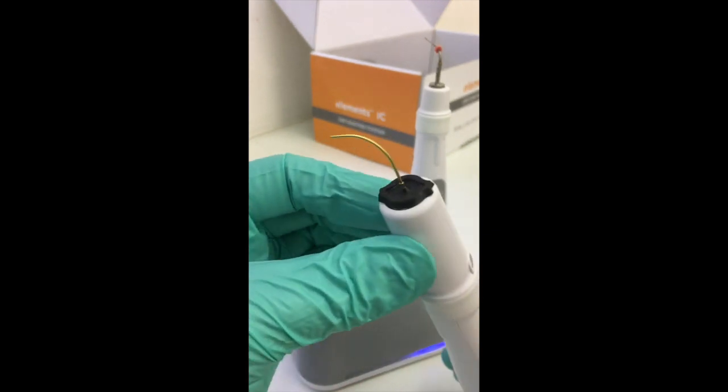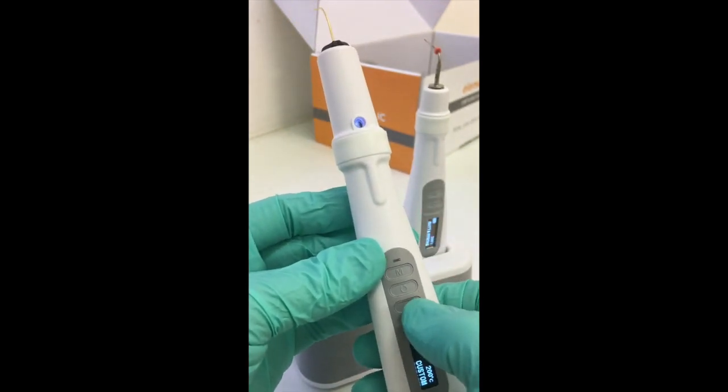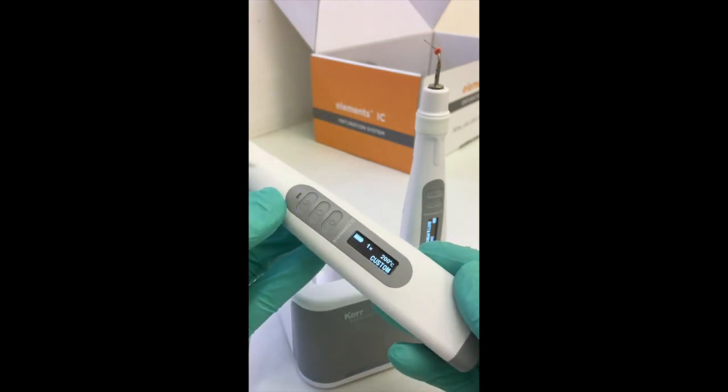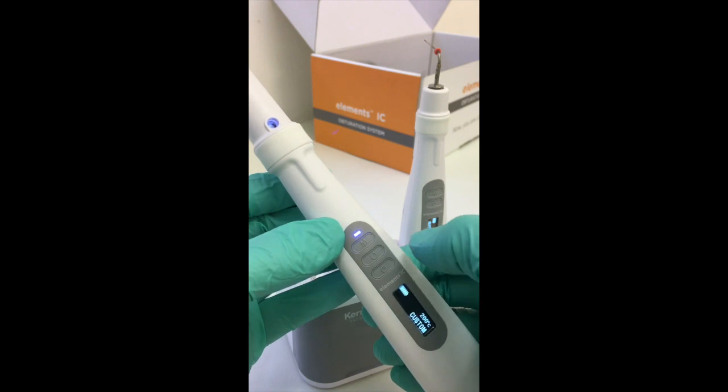The little probe which applies the GP through the compactor is the same as in our original unit, and the controls are very similar — three buttons, very intuitive.